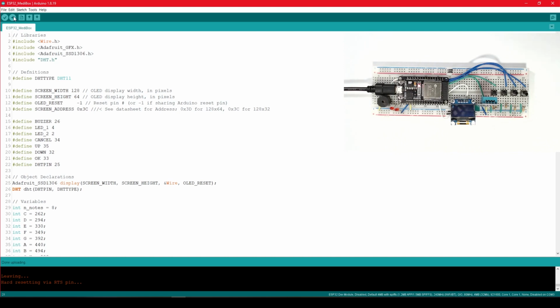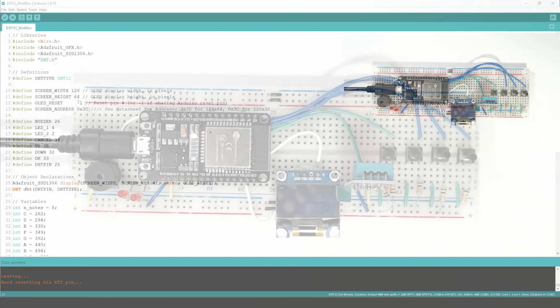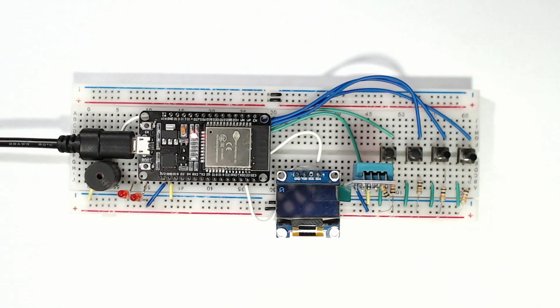You can see that it is behaving as expected. The time is updating as the seconds go by. Now we will see how the other functions are behaving. For that, we will use the 4 push buttons, with the leftmost being OK, then down, up, and the rightmost for cancel. First, I will set the time.